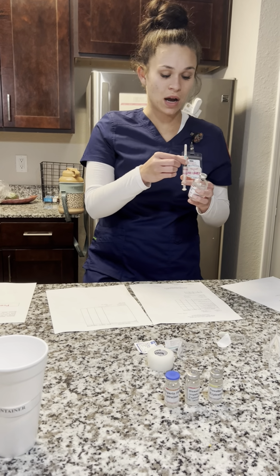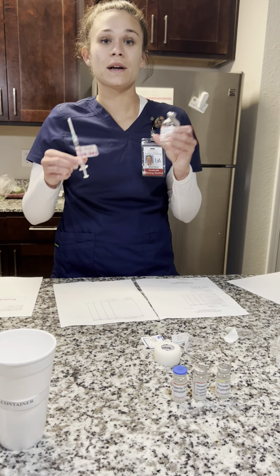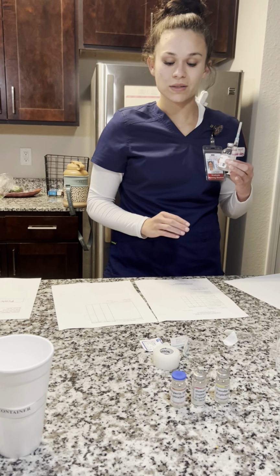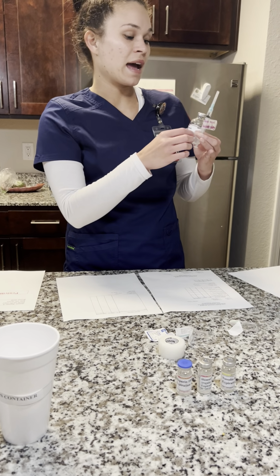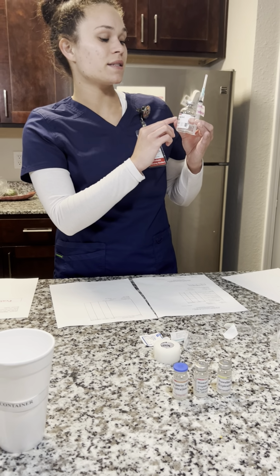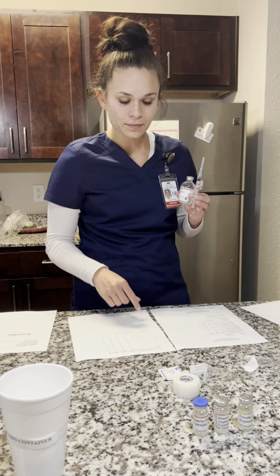Next thing we're going to look for is the right medication. It's morphine sulfate. This is morphine sulfate right here. I have morphine sulfate in here. And the patient care order form also says morphine sulfate. The dose is 5 milligrams. I have a 1/2 milliliter of morphine sulfate in here because my vial, once again, says 10 milligrams per 1 milliliter. So that would mean I need a 1/2 milliliter to be 5 milligrams, which is what I have.